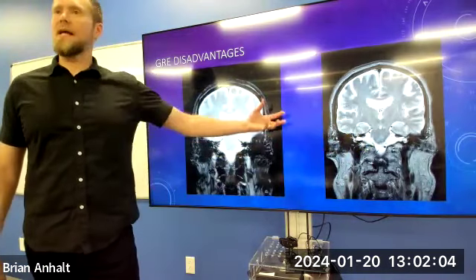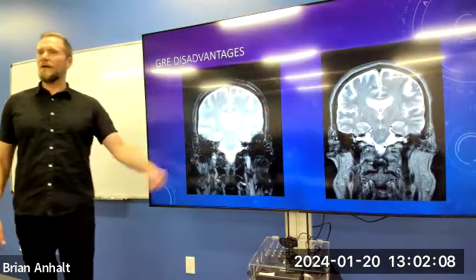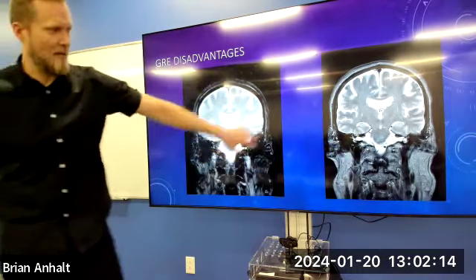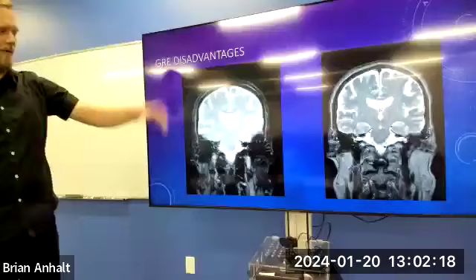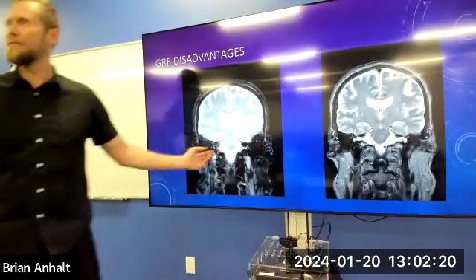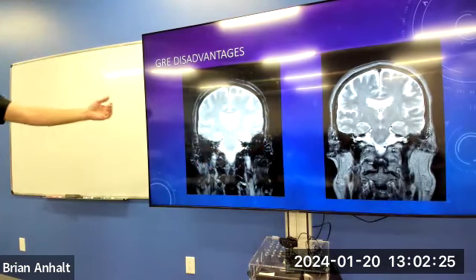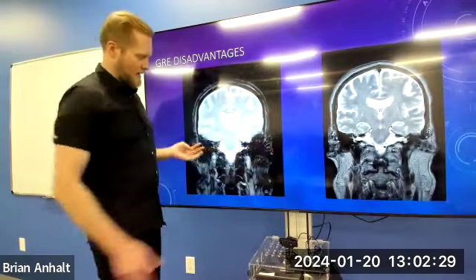That is an inhomogeneity or susceptibility that we are not getting rid of. We're not eliminating it with T2 star, right? So we've completely dephased this area, this signal, because we haven't eliminated T2 star effects. And there are a lot of them in this area. So sensitive to inhomogeneities. There's an inhomogeneity here. All my data is gone.